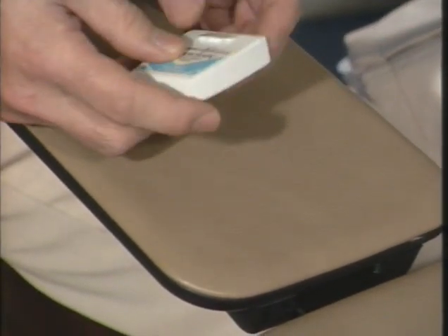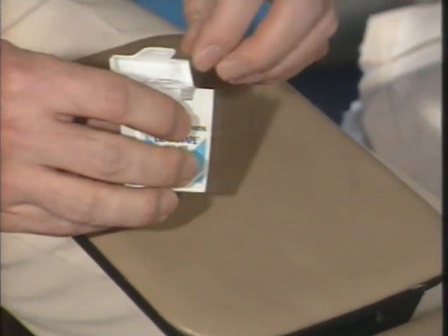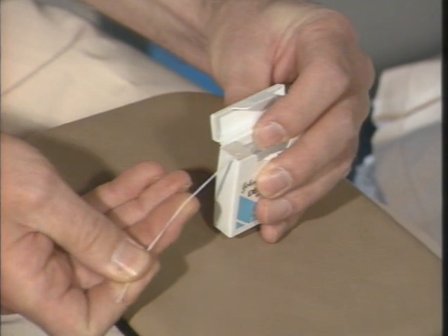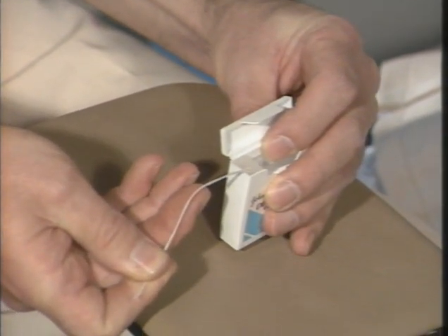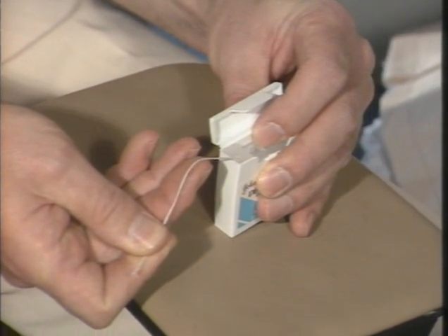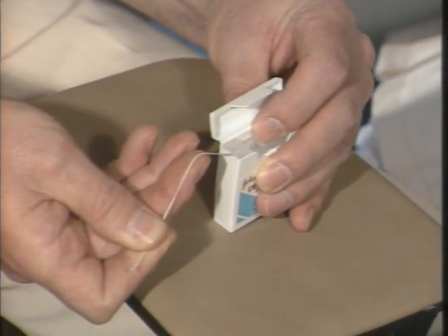Dental tape, which is a modified form of dental floss, is used to ease the rubber dam in between the tooth contacts and to feel the contacts of the teeth prior to placing the rubber dam, just to make sure that there aren't any snags or to feel how tight or loose the contacts might be.